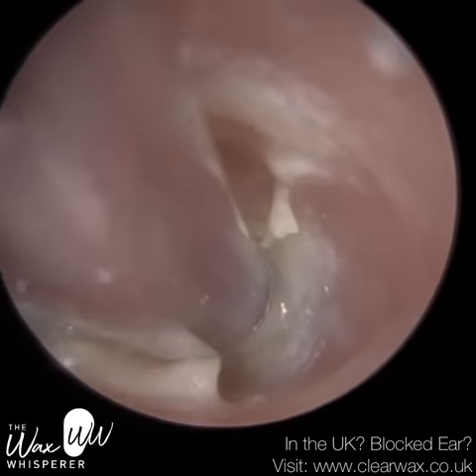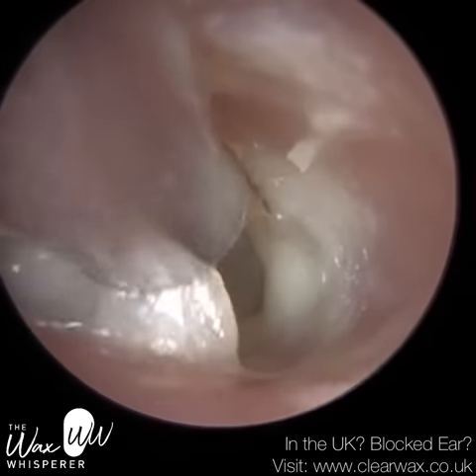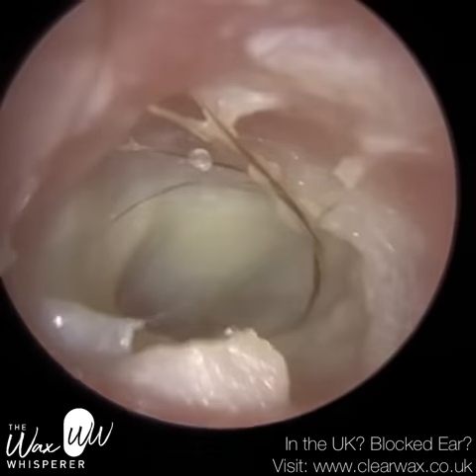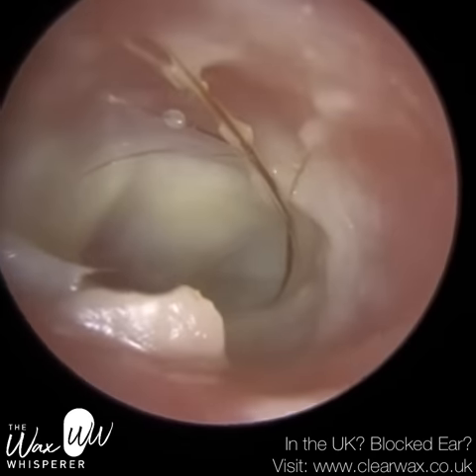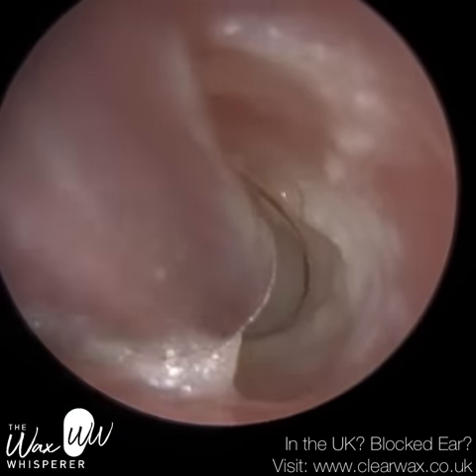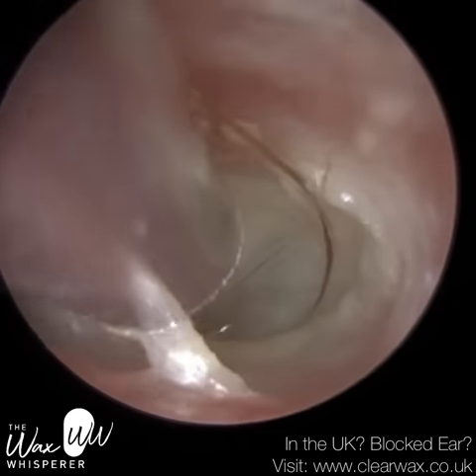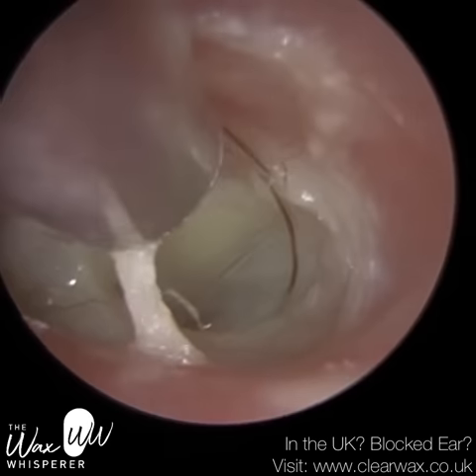They visited their GP who prescribed some topical antibiotic spray. They were advised to visit myself to have this really thick purulent discharge from their left ear removed, because that will give a chance for those topical antibiotic sprays to really penetrate the surface of the skin and try to eradicate this bacterial infection. They had been placing a piece of cotton wool in their ear, and the other day they realised the cotton wool went missing. Because their ear was already blocked, they didn't suspect it was lodged in there — they were aghast when they attended and realised the cotton wool had got stuck.